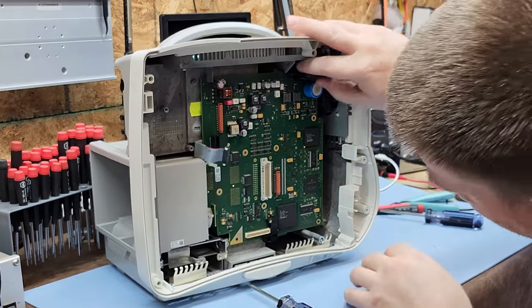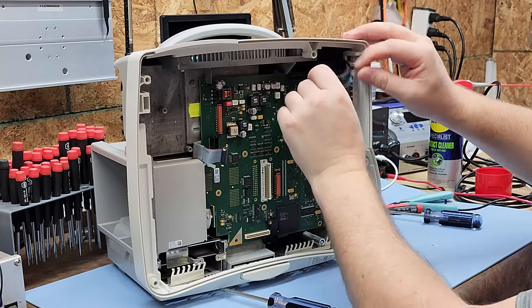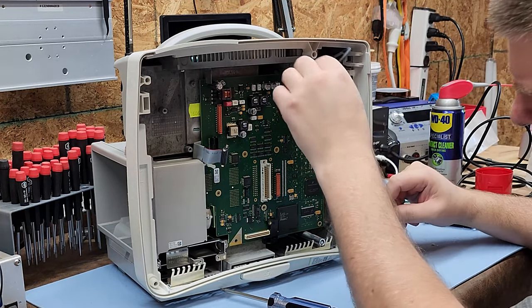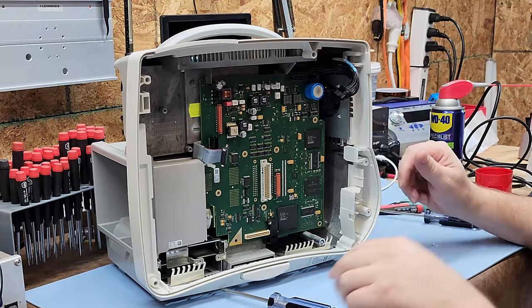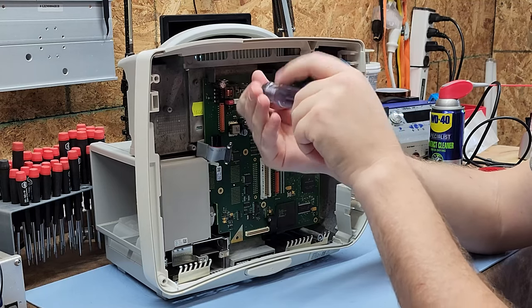Here's one more cable to undo — this is the power supply cable. And what's this? It's a little fan — so it does have active cooling, a small fan for the power supply.